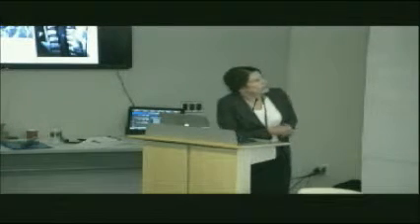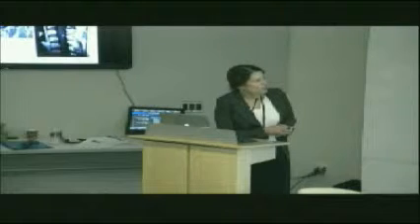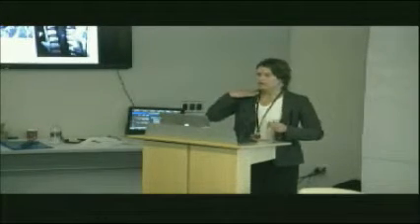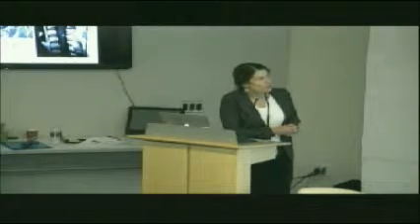So there's one study that was done that looked at an individual who had a lesion in their spinal cord. You can see it here. This is as though you cut my spinal cord like this and kind of laid it out. That's what you're looking at. This little white part here shouldn't be there. It should look all gray. This is a sagittal view like Dr. Becker showed, where this is your spinal cord. This part here and this little white area is not supposed to be there. That indicates damage.